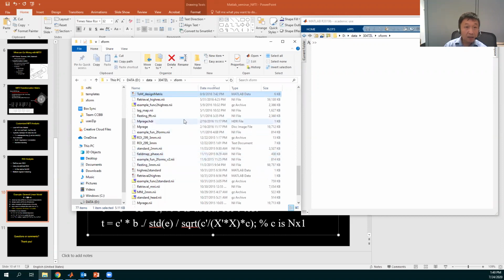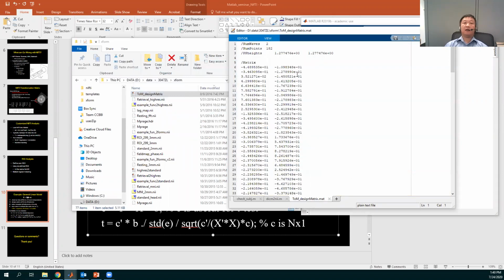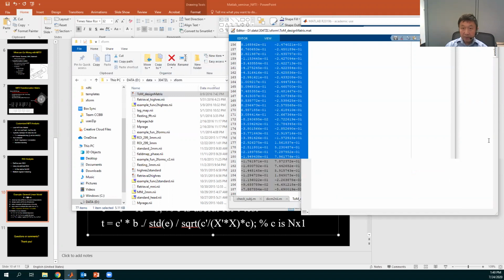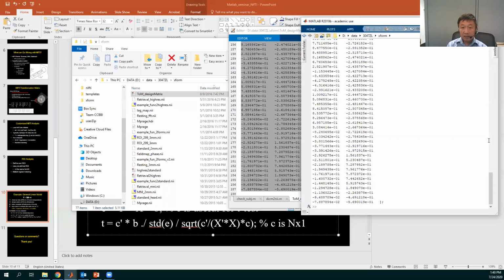So yeah, I think this is a text file, although it shows as a .mat file. That's from FSL. Yeah, it is a text file. That's an FSL design matrix, some header and 2 columns. And I'm going to copy, paste these 2 columns, assigned to X.